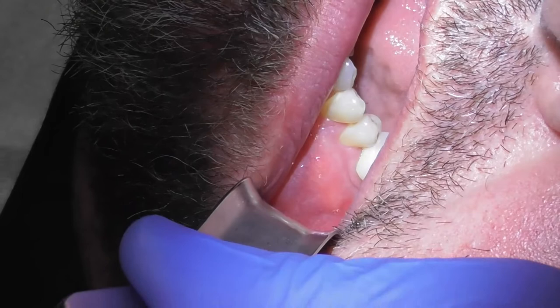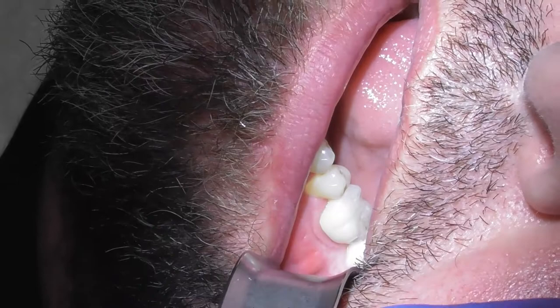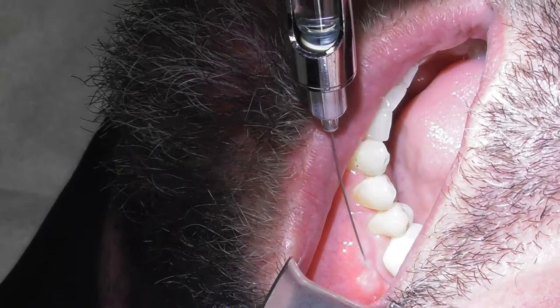Let me do one more thing before I give you more local — I'm going to just touch on the top here to see if the gums on top are numb. Can you feel that at all? I'm going to give you a little bit more numbing medicine in this area too. This stings a little bit — one, two, three — a pinch there and then a burn.